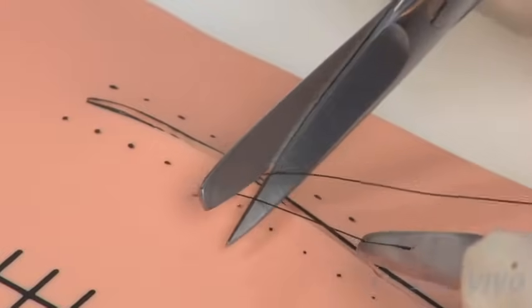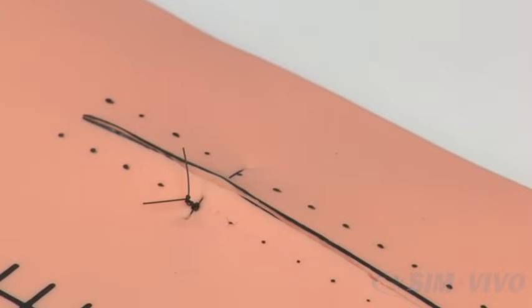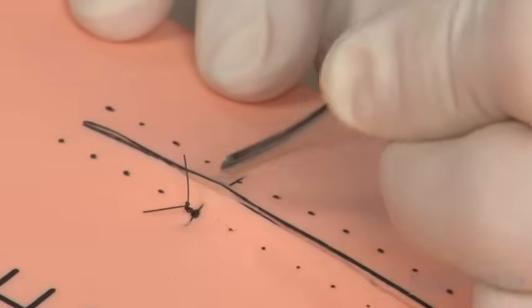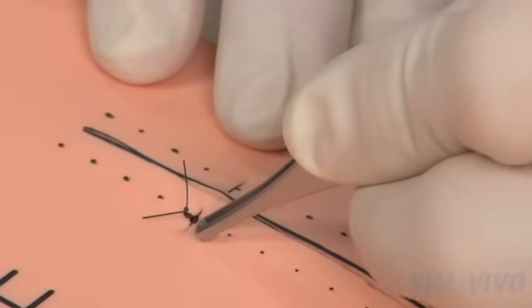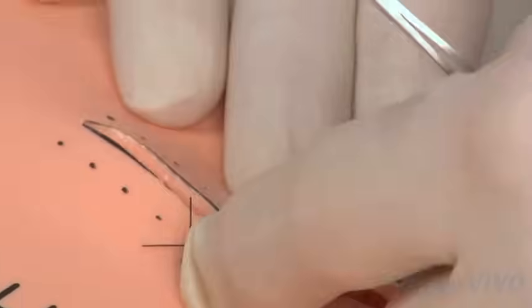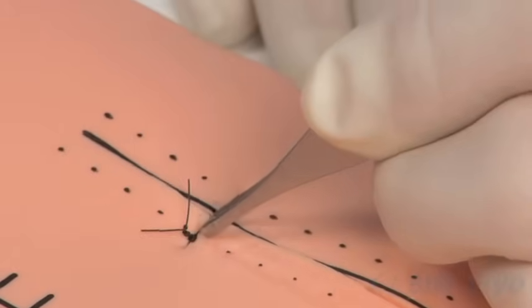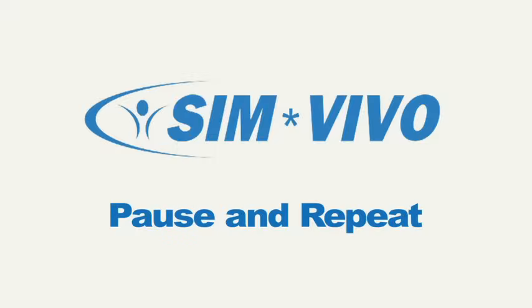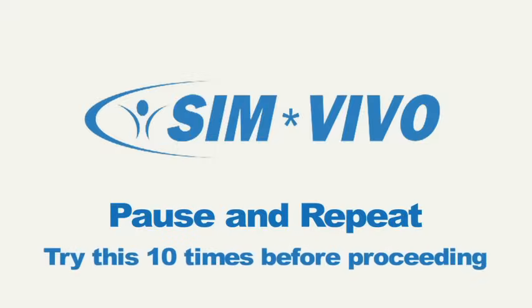And then when you're done, bring in the scissors to cut the tags. Notice what you have. You have a suture with ends on both sides. The tension has been taken off of this wound with the big sutures that were placed and actually averted the edges for better healing right here in the center with our smaller bite. Now, practice this ten times before moving on to the next exercise.